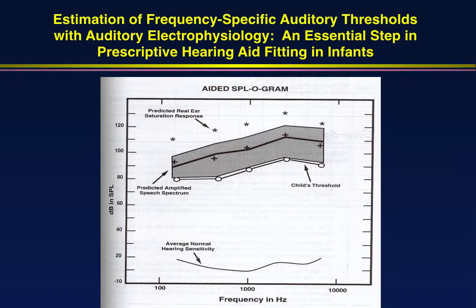Now, of course, sometimes the child's hearing loss is so great that they will not benefit from amplification. But again, ASSR can help us reach that conclusion much quicker.